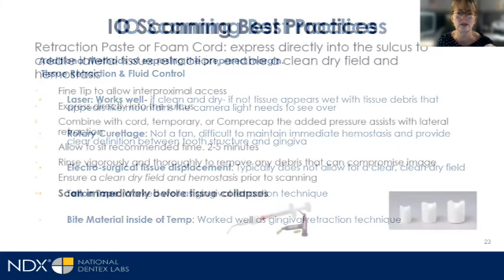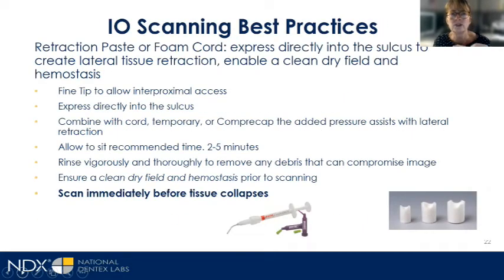The other thing with retraction paste is to remember that as soon as you rinse and dry, you want to scan immediately, before there's an opportunity for the tissue to collapse. That's a big deal. So I'll go into private practice and the assistant rinses everything off, and then she goes and gets the dentist to come and scan. It's like, no, now the tissue's already collapsed. So it needs to be scanned immediately after rinsing.